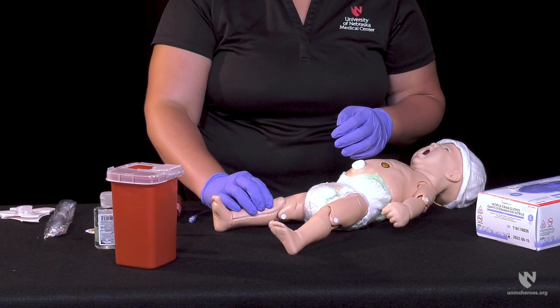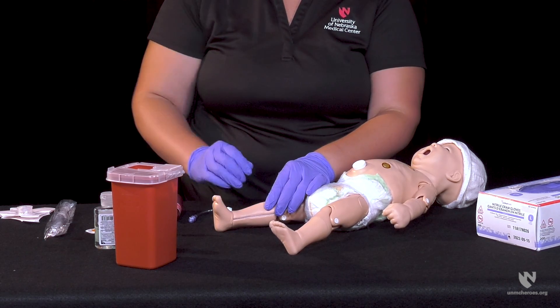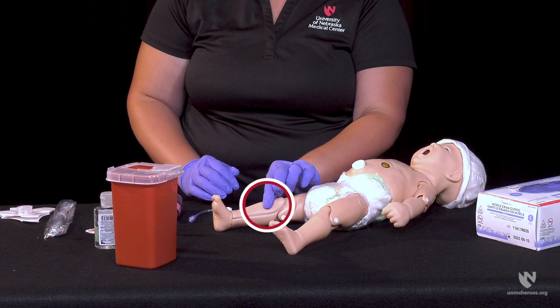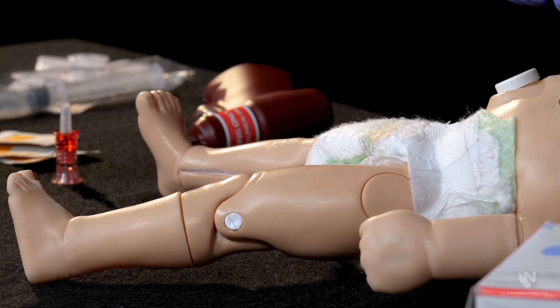For this demonstration, placement in the proximal tibia will be used. Begin by feeling for the tibial tuberosity. Placement for the needle will be two finger breadths below this point. Prepare the skin by using an appropriate disinfectant and allowing it to dry.